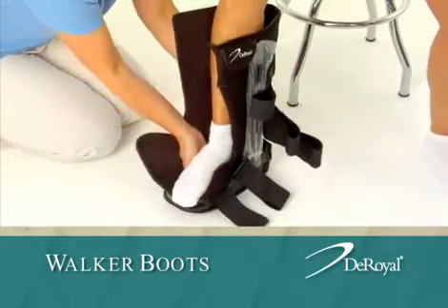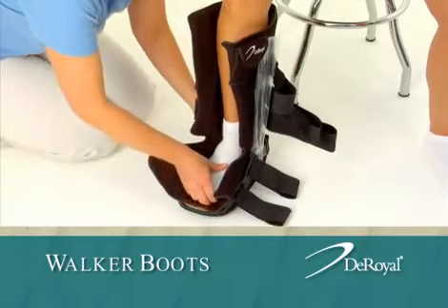Place the leg into the walker boot, making sure the ankle is at a 90-degree angle.